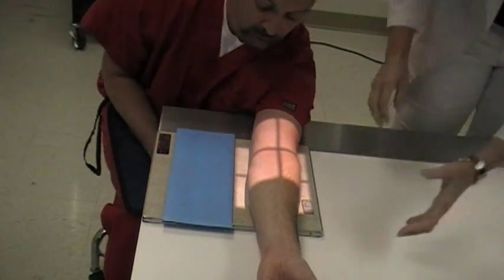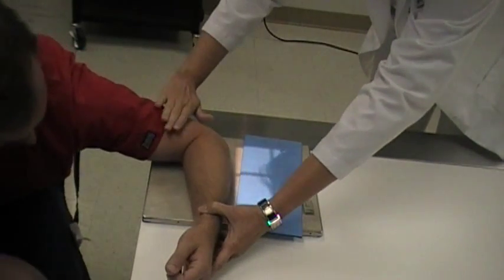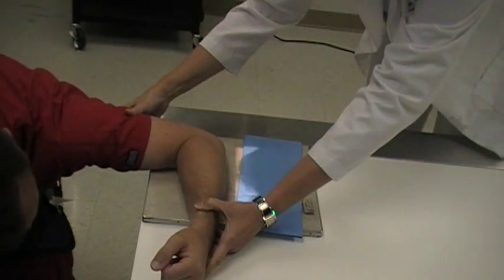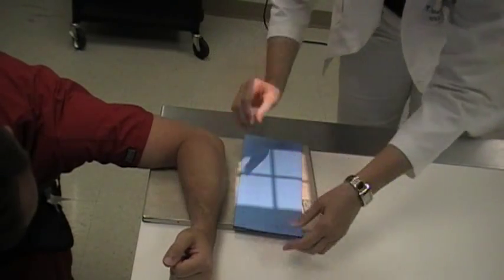Our lateral elbow will be, you'll bend the arm 90 degrees. Make sure the humerus is touching. Have a 90 degree bend, have the hand on its side.